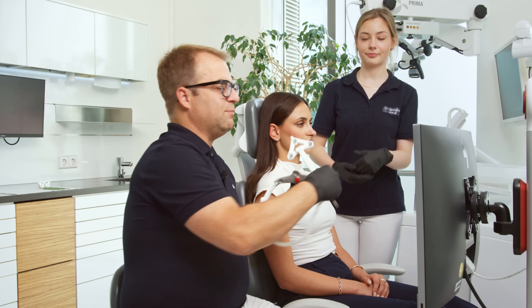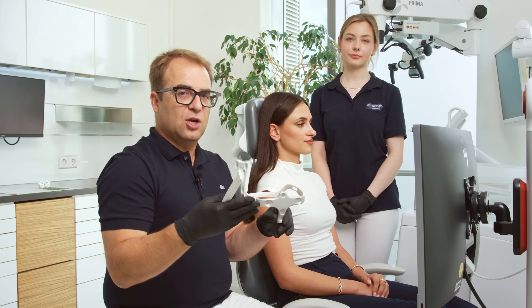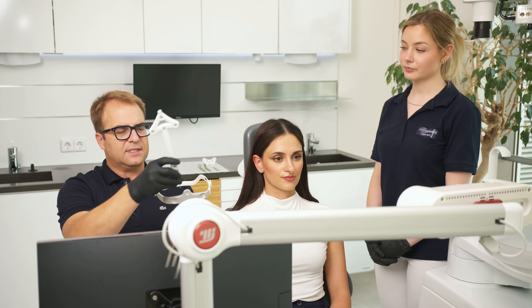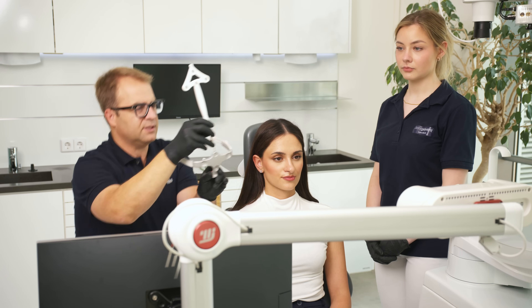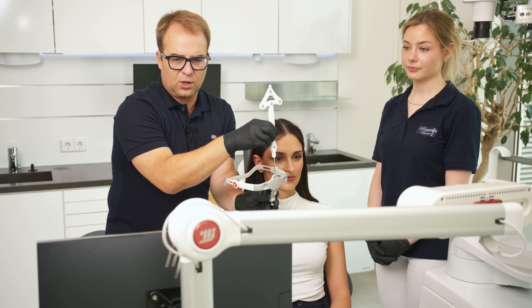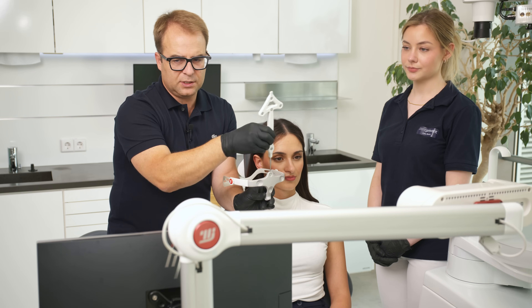Now, once the models have been uploaded and the reference points located, we proceed to calibrate the Mojo device. This involves the tiara and the wand. The calibration starts automatically, and I perform a rotating motion.